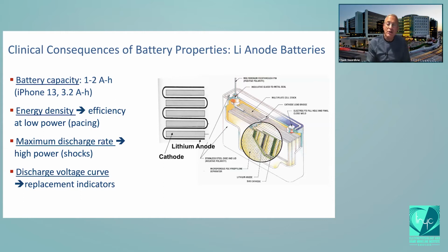I do know the Abbott pacemaker one. The Abbott pacemaker problem was that as the battery depleted, lithium crystals formed on the anode electrode, and those crystals increased the size of the electrode and ruptured the separator, connecting directly to the cathode.